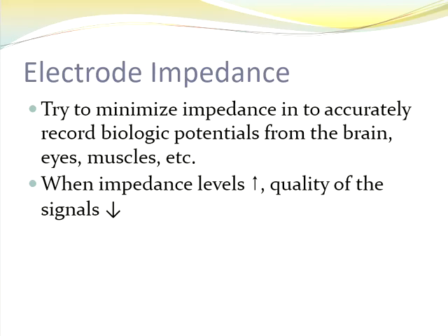It's essentially measuring the resistance, how well we were able to prep the skin and prep the areas that we're applying the electrodes to, to get a good signal. So the better your impedance levels, the lower they are, the better quality of your signals.